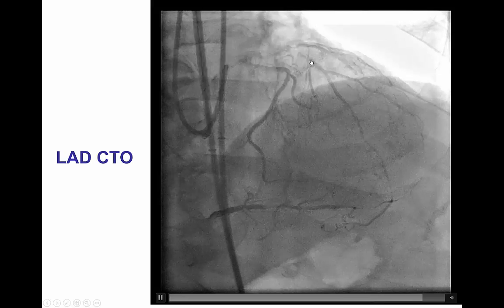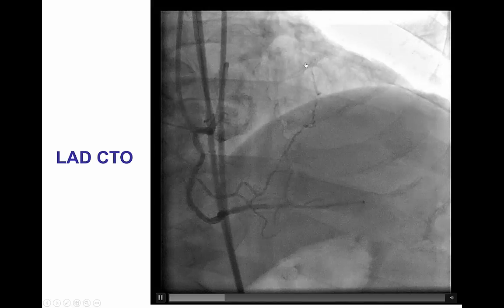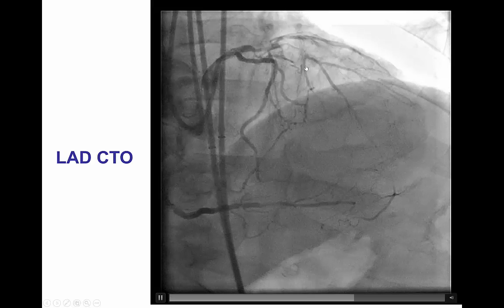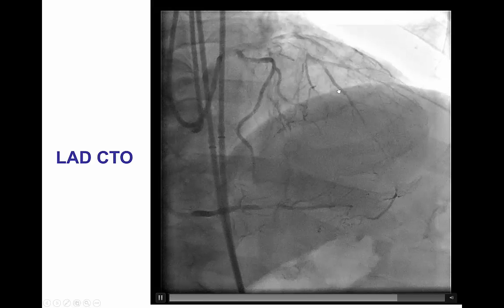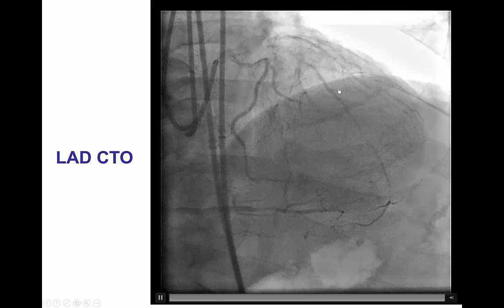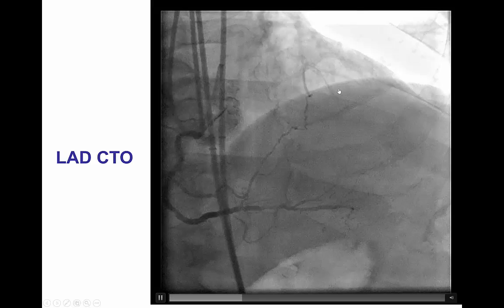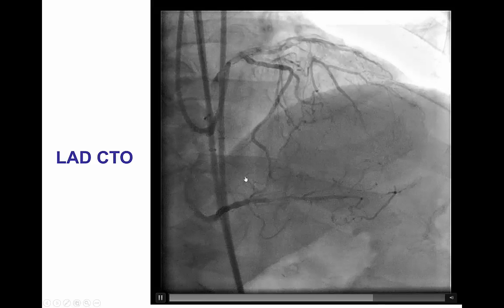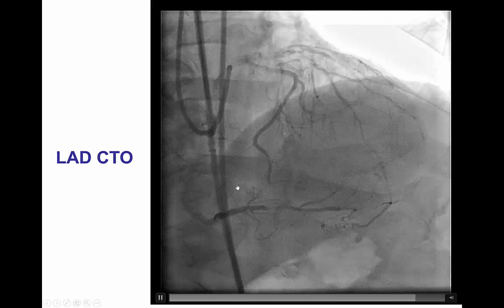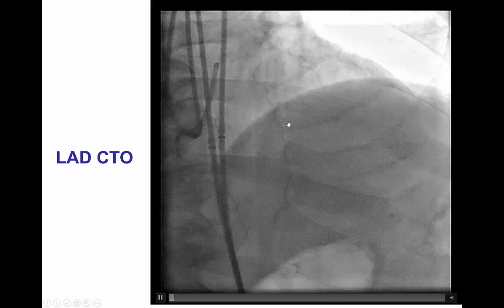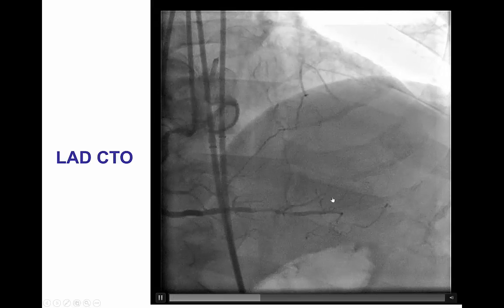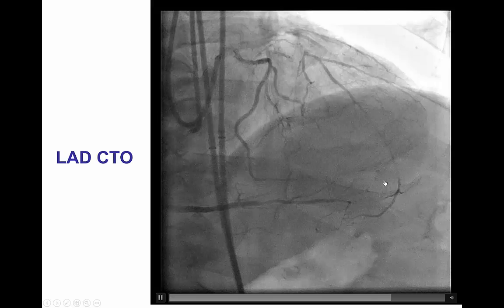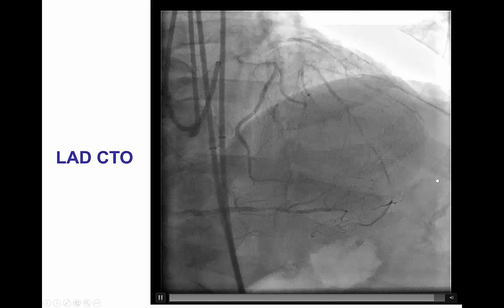However, there is a branch at the distal cap — one branch that connects to an epicardial collateral and the other being the main LAD. There is also a Vieussens collateral coming from an acute marginal, and epicardial collaterals coming from the PDA into the distal LAD.